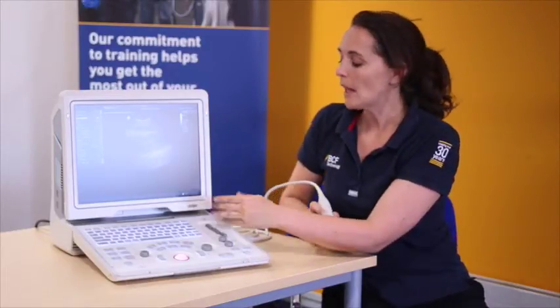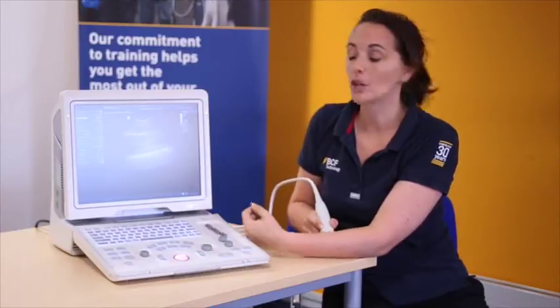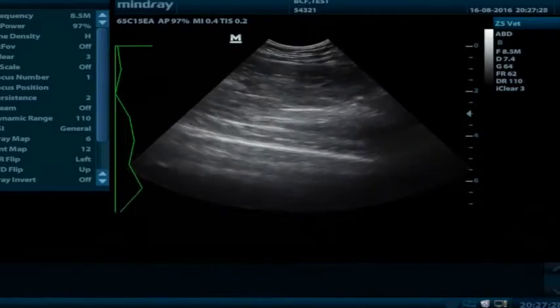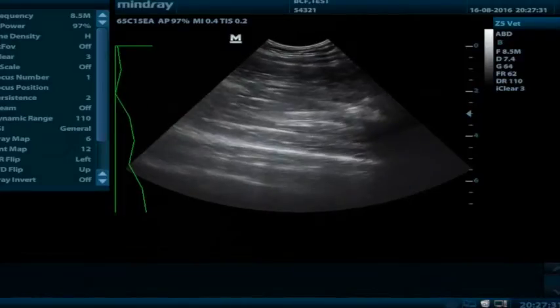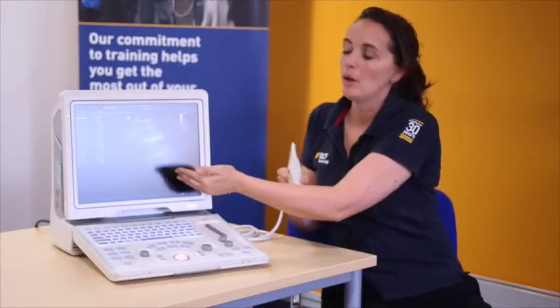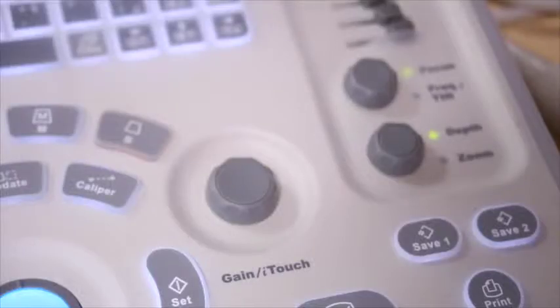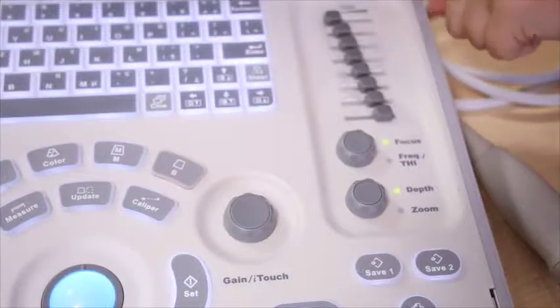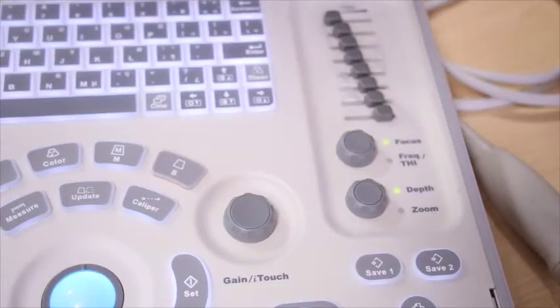The next thing is your time gain compensation, or TGC. That is a fancy way of saying your gain as you go up and down the screen, and this is controlled by the sliders on the right-hand side of the machine. As I move an individual slider, it correlates to different aspects of the beam coming out of the probe. As the beam goes further away from the probe, the returning echoes become quieter, so we just want to amplify or increase the gain at that particular level. For that reason, the TGC sliders are often seen in a diagonal position.